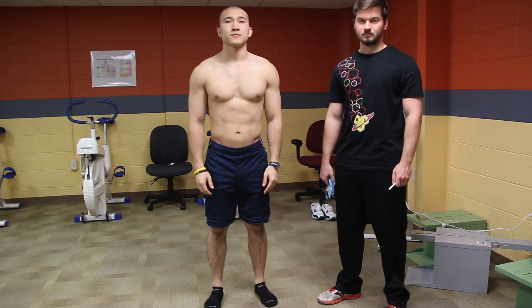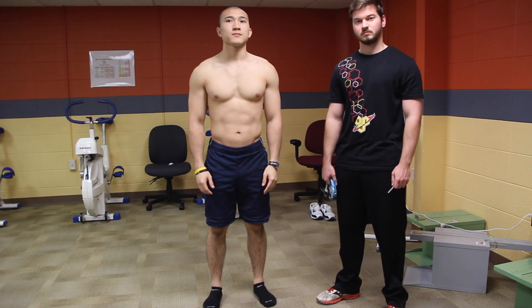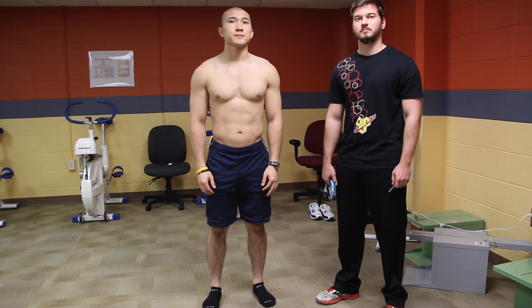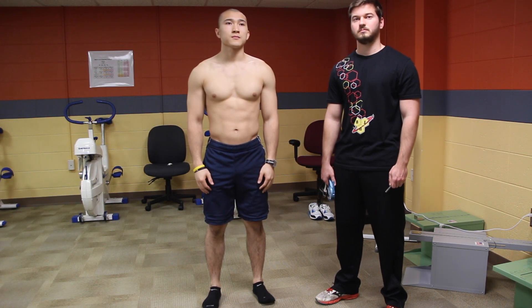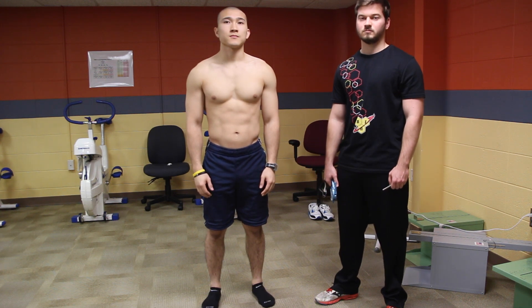When doing your body comp, you're going to be measuring seven different skinfold sites, all on the right side of your client's body. You're going to make sure that you take every site two times. If your measurements are not within two millimeters of each other, you'll do a third measurement and take the average of the two closest numbers.